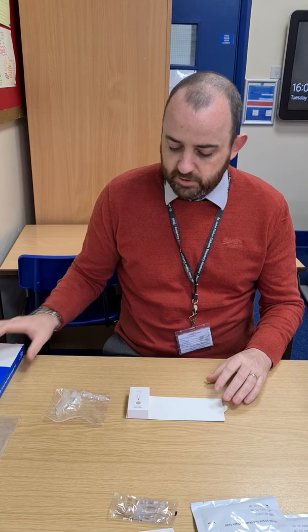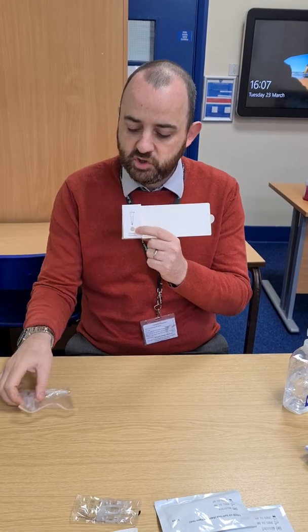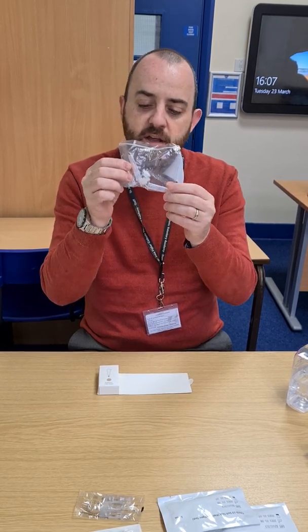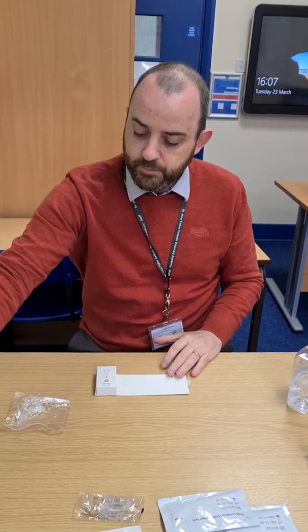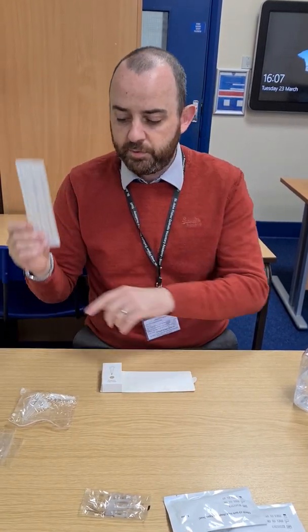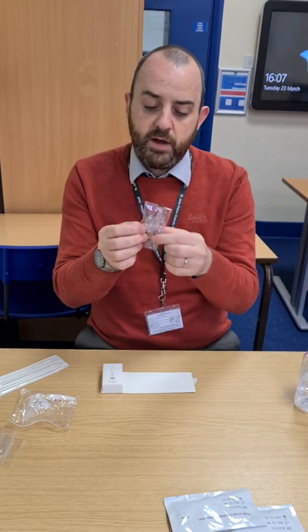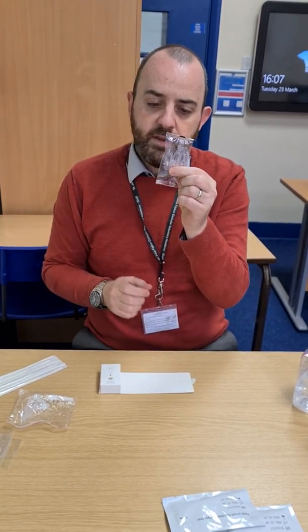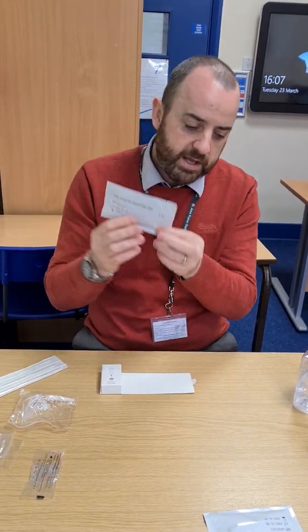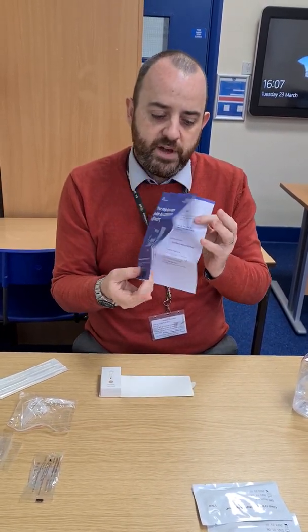Once you open the lateral flow test box there are several things inside. There's a cardboard insert which is important to hold the test tube for the drops. You'll have a bag containing three tubes for dropping, three disposal bags for your used swabs, three swabs, three vials of liquid, three lateral flow devices in sealed packets, and an instruction booklet to refer to at any point.